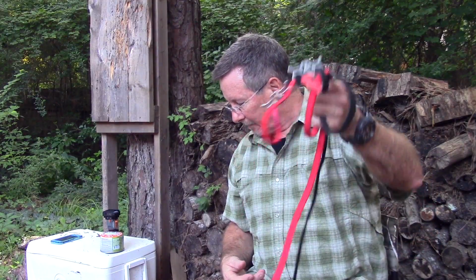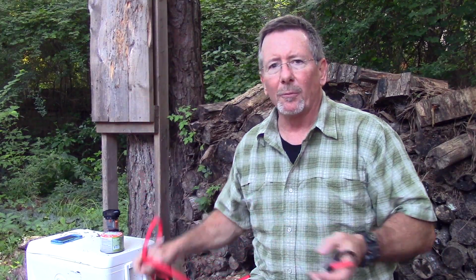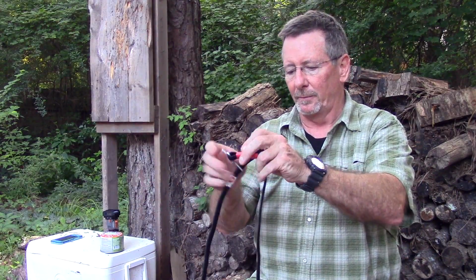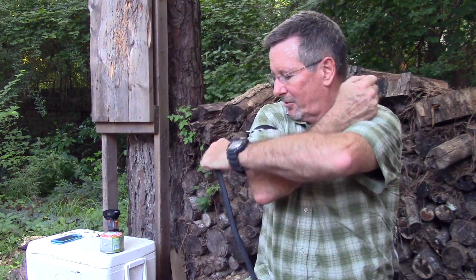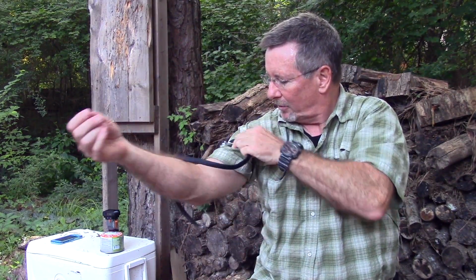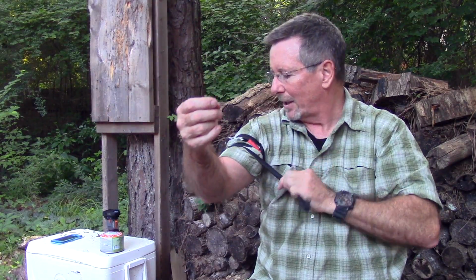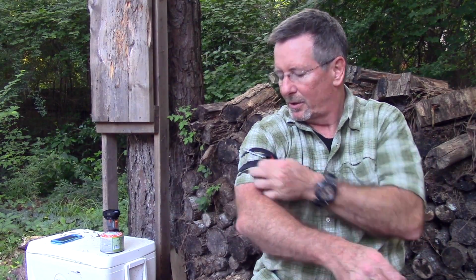The RATS tourniquet is about $18, and what I like about it is, from a self-aid standpoint, it's really easy to apply to yourself. Same thing, right arm. Using my weak side arm, just loop that through, put it on your arm. You pull it with one hand, start getting it tight, and just wrap it around. You want to keep the wraps close together, stacked, so you make a wider restrictive area, maybe a couple inches. Then you pull it out, and you've got just enough. You hook it in there, and you're good. And that'll get you to the emergency room.